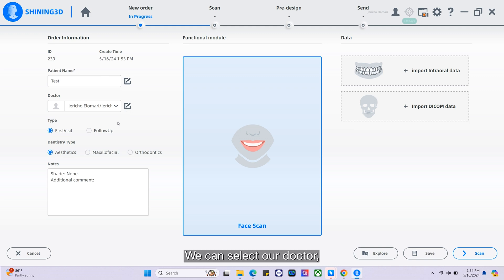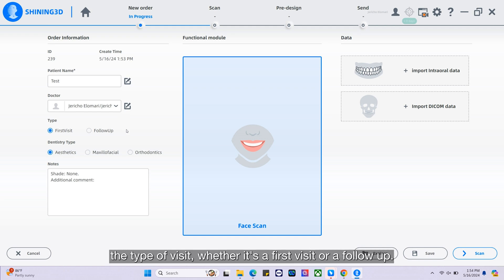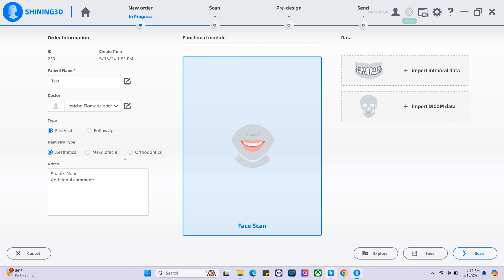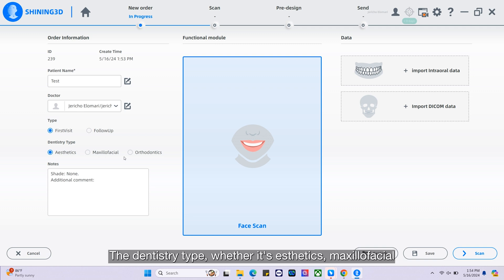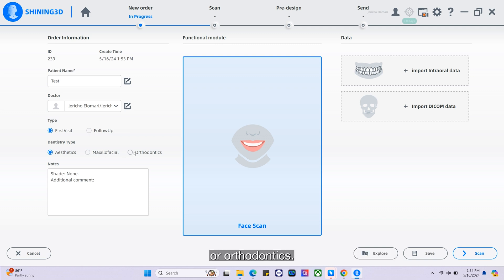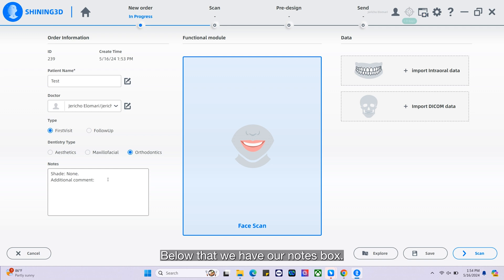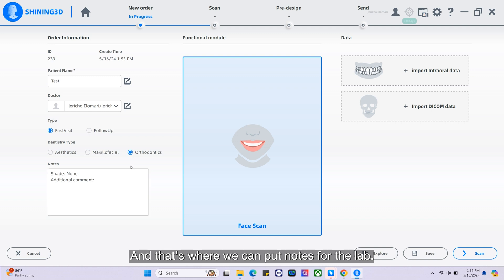We can select our doctor, the type of visit, whether it's a first visit or a follow-up, the dentistry type, whether it's aesthetics, maxillofacial, or orthodontics. Below that we have our notes box where we can put notes for the lab.